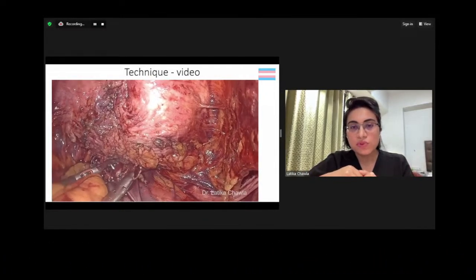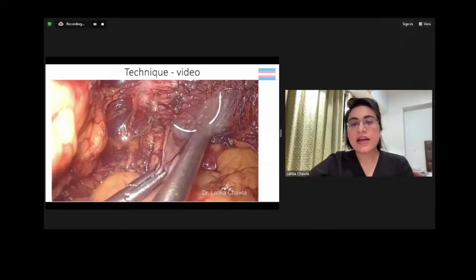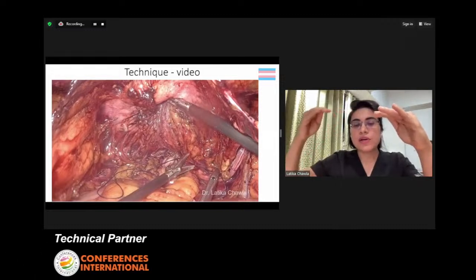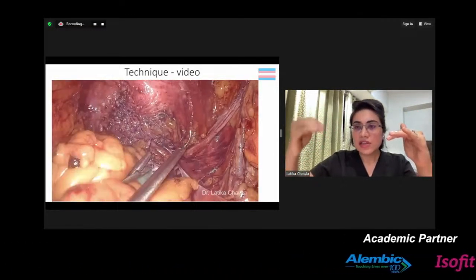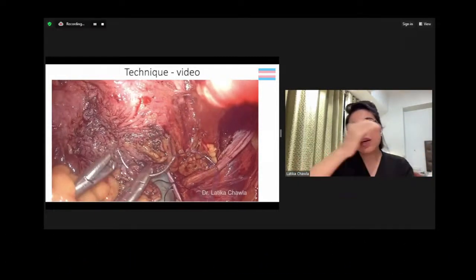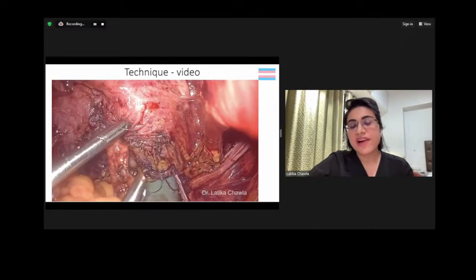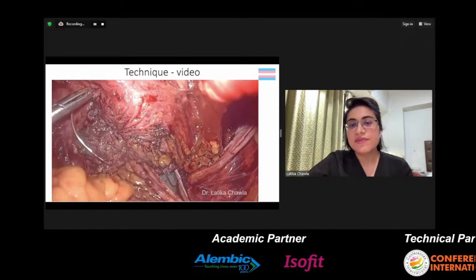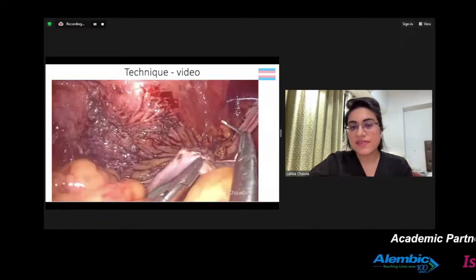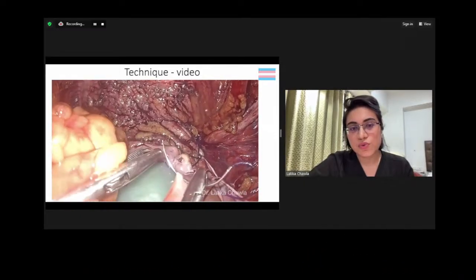So after suturing on both the sides, we also try and go higher and take a nice purse string suture from the urethral tissue anteriorly, from the peritoneum laterally, from the serosa of the sigmoid posteriorly, and keeping the silicone mold in situ, we close the apex of the neovagina. Now, this silicone mold stays inside for about 5 days post-op, after which will be the first time where we will take out the silicone mold, flush the cavity to take off any kind of slough that is there, and reinsert the silicone mold. Here I'm taking the purse string suture.